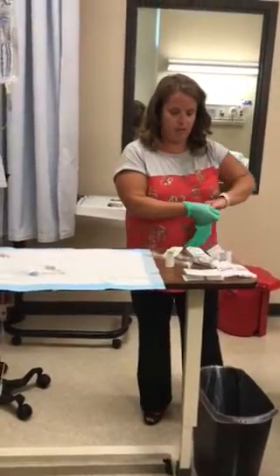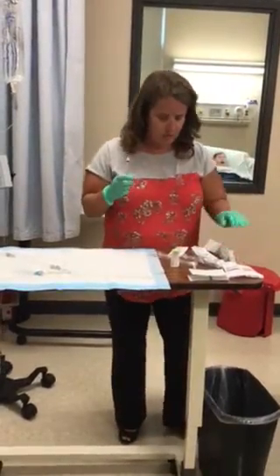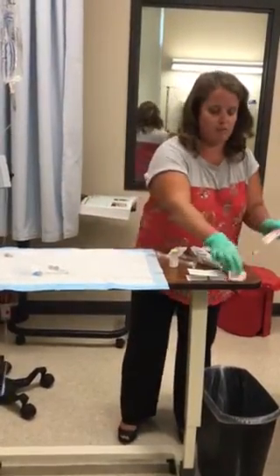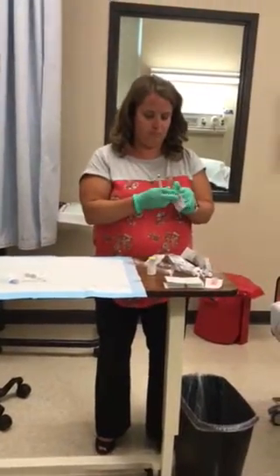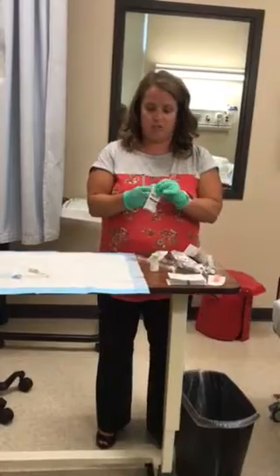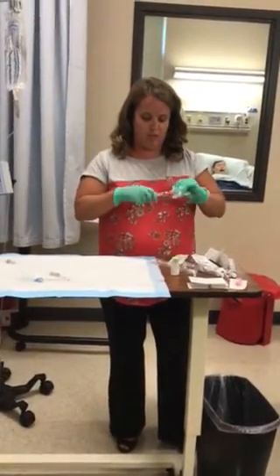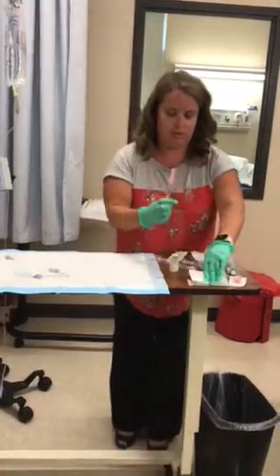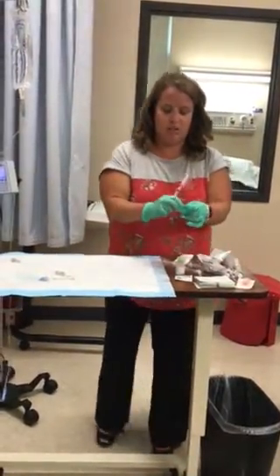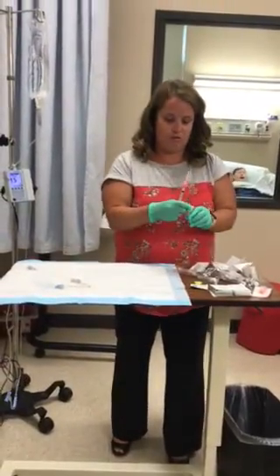So we're going to get our Ketorolac ready. I have a one mil syringe and I have my needles to draw up my medication. Joint Commission wants you to do med prep at the patient's bedside, but you may also do it in the medication room with an instructor. Just make sure you label the syringe with the patient's name, date of birth, and what medication is in there so you know where you're going.